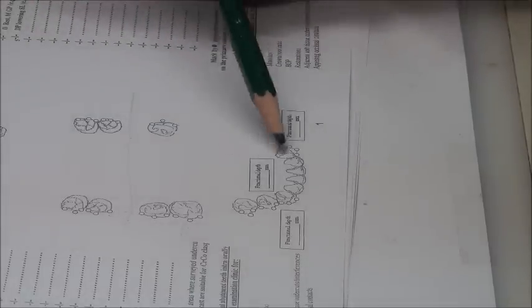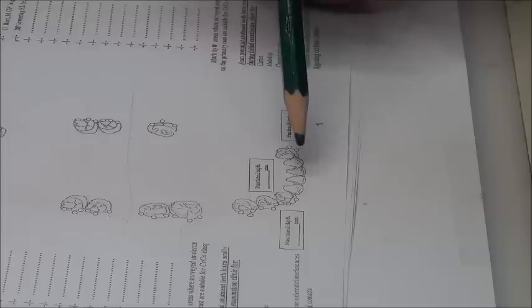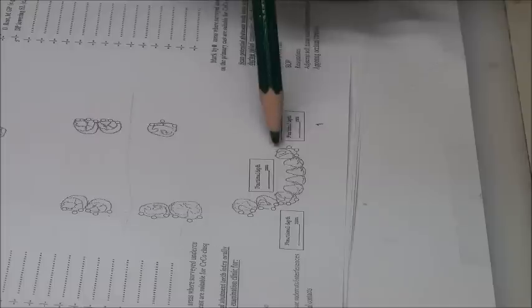What else? All gingival approaching. Or in the acrylic saddle, we place stress-releasing attachments, like a hinge between the components. So the idea is that here we need to release the stress on the abutments, and usually the abutments we release the stress on are premolars and anterior teeth. So to release the stress, I'm going to the RPI system here.